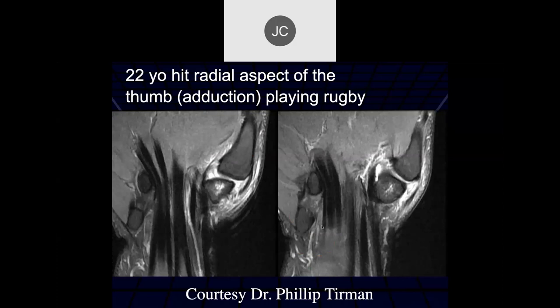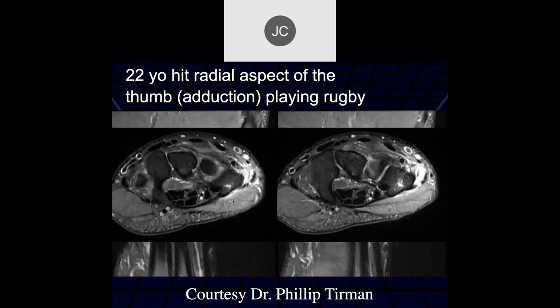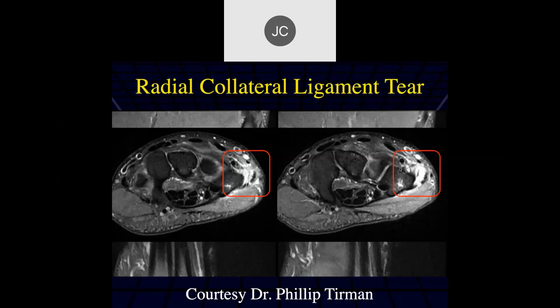22-year-old hit the radial aspect of the thumb playing rugby. Looking at the anterior oblique ligament, it looks irregular — partially torn. The posterior oblique, the proximal portion, looks torn as well. On the axial views — that looks like it could be the abductor pollicis longus tendon — I think you've got a little bone injury here as well. But this is predominantly a radial collateral ligament tear from a probable dislocation.